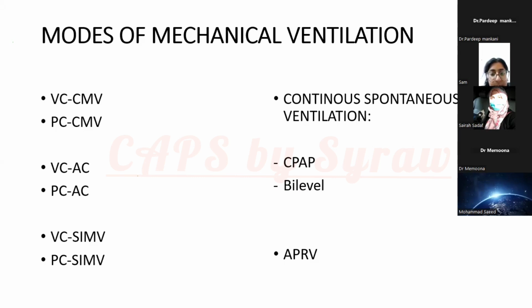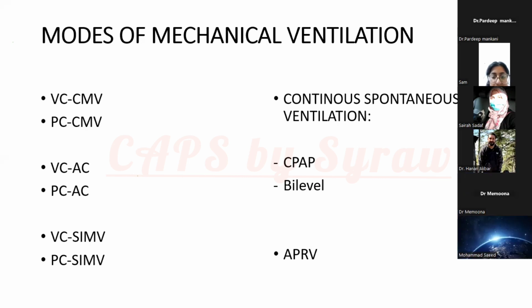One question for the mode. I have been observing a new ventilator here, Mindray A9. I have seen one mode there, PRVC mode, pressure regulated volume control. Any information regarding this mode?